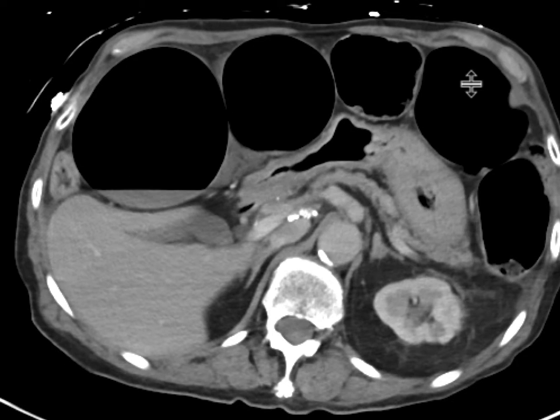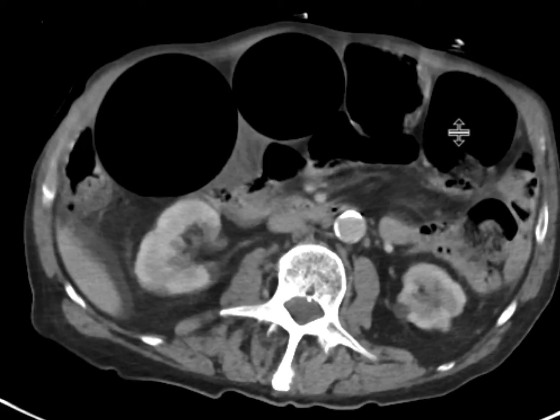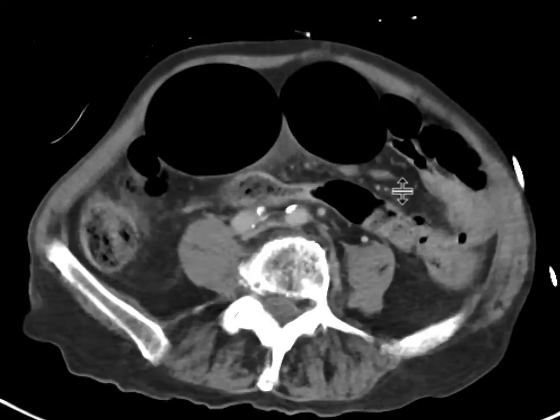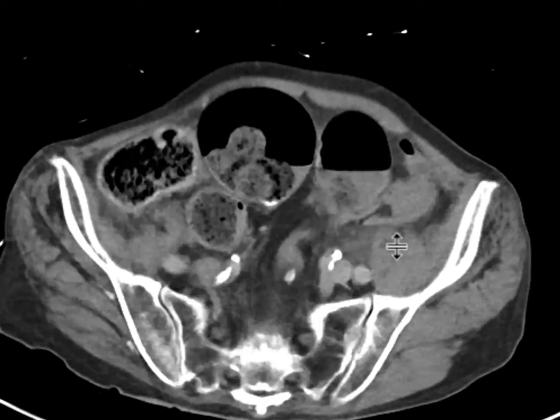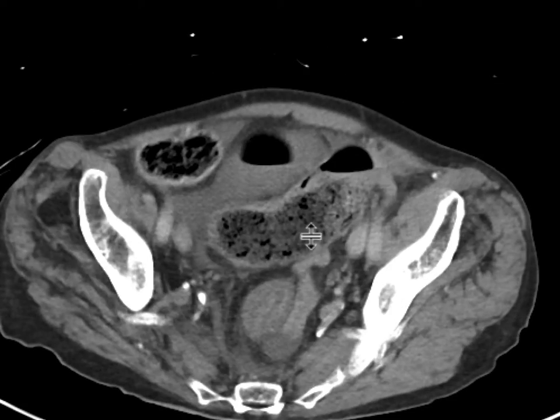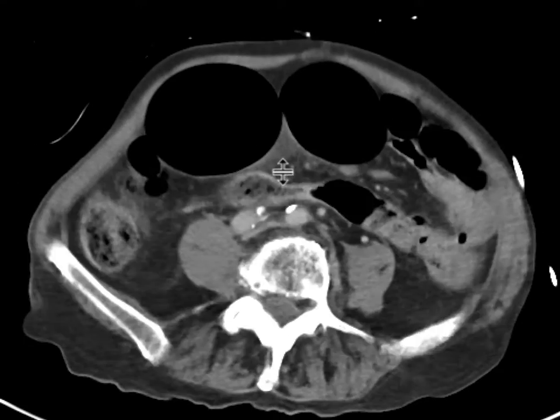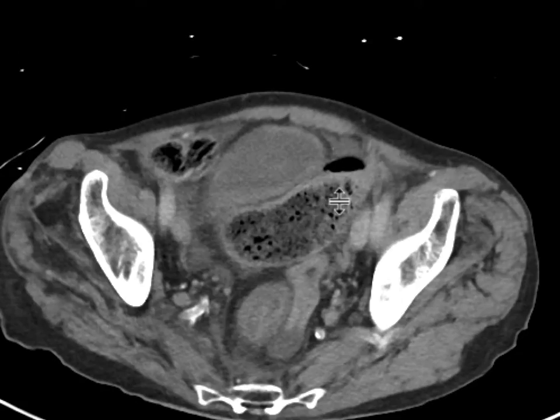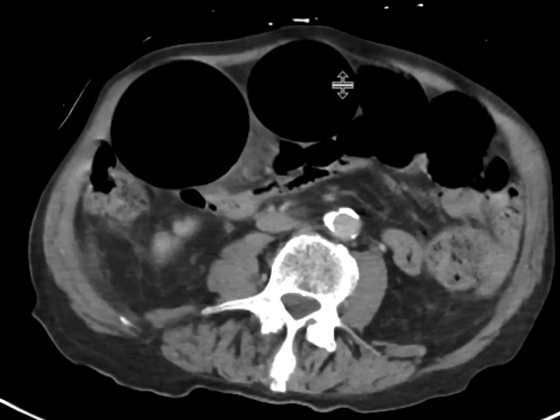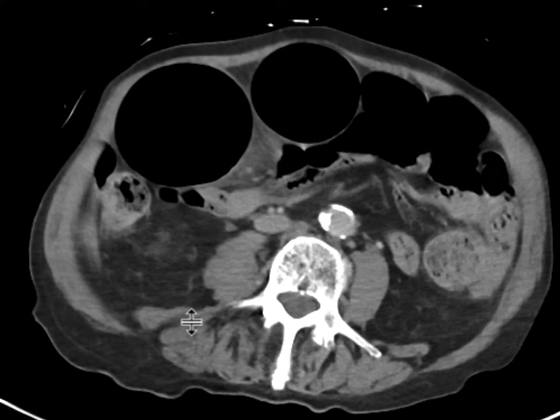We focus on these loops in particular and follow them down. This one over here goes to the left lower quadrant, leading to loops that correspond to the sigmoid colon. We'll follow this back up to the next loop and continue tracing from there.